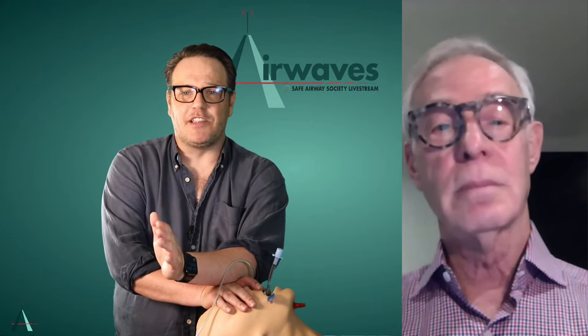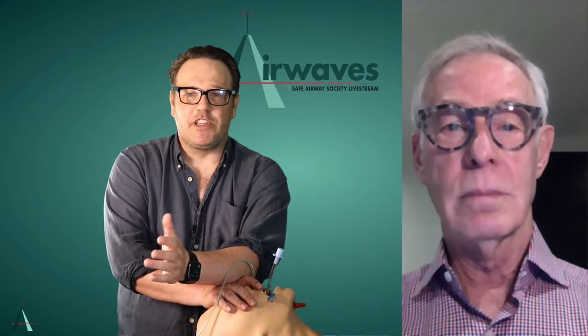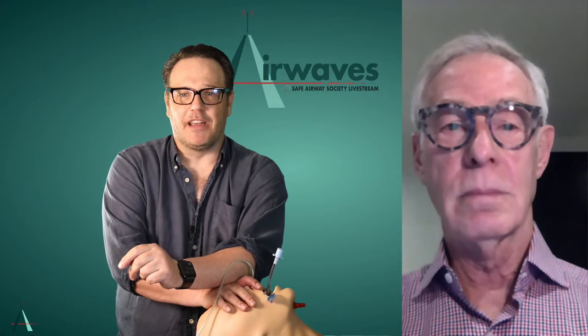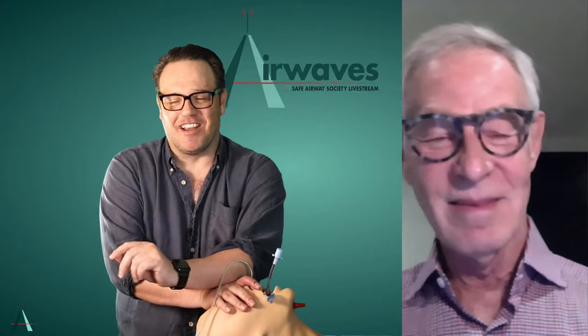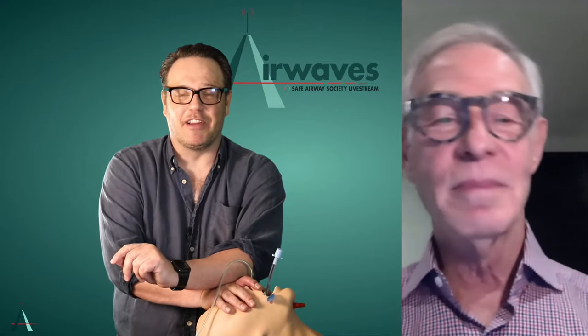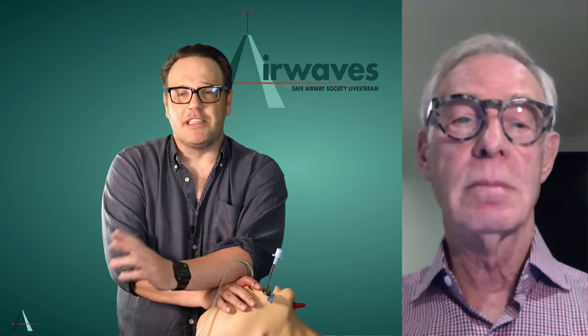But if you don't practice with it and get proficient with it, you won't be able to use it when it really counts. It's not something you can grab for the first time out of the drawer when you hit a difficult airway. So Richard challenged me to default to hyperangulated blade for somewhere between 3 months and a year. He may have said 3 months. I ended up going for a year. The plan was for me to go back and keep my hand in by doing a couple of hyperangulated intubations a week, but I just thought it was such a better technique that I've stuck with it routinely now as my default.